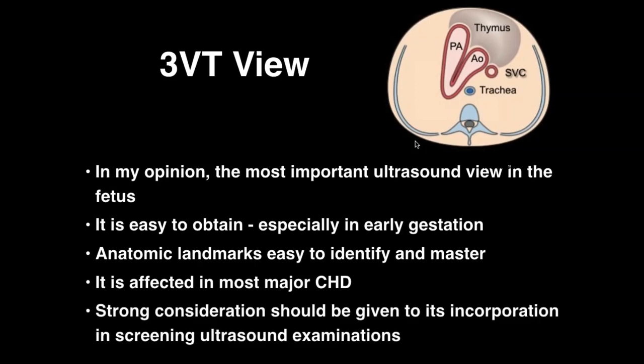And it should be strongly considered, I'm hoping, for incorporation in the screening examination, and I'm hoping to be an effective advocate for this view to really enhance our ability to look at the heart and also to diagnose more conotruncal anomalies than we have done in the past.